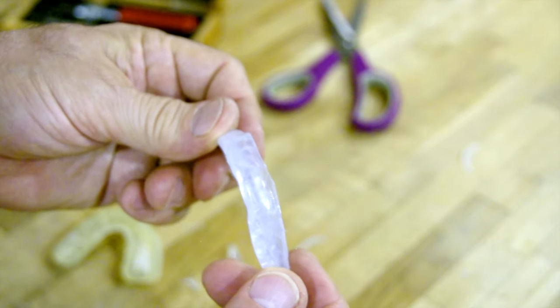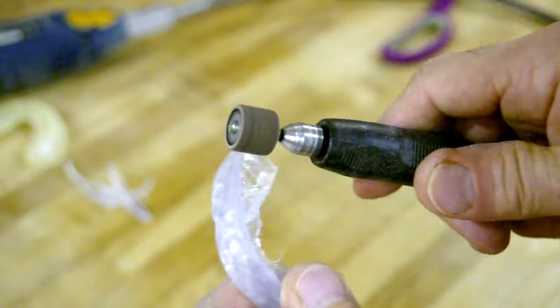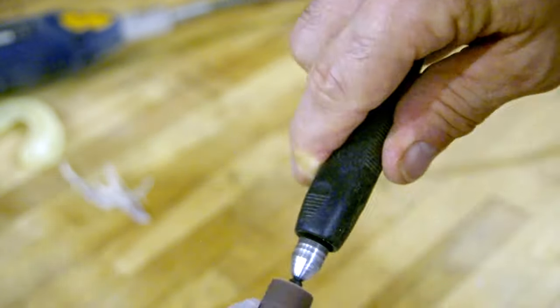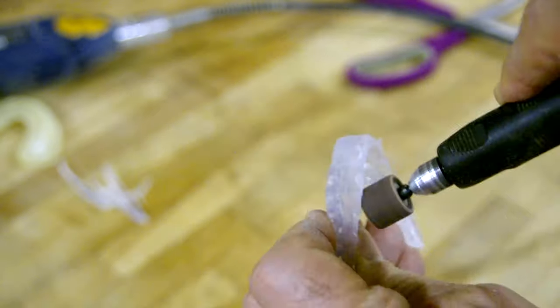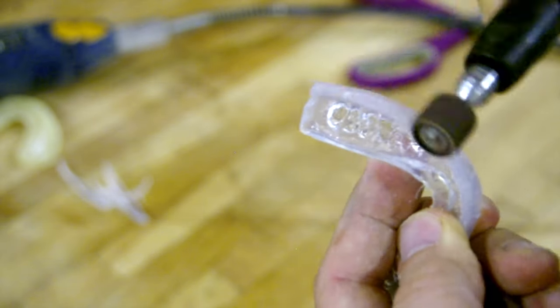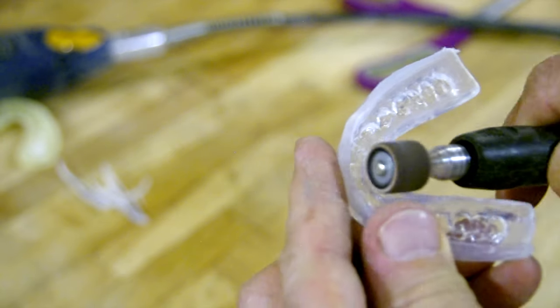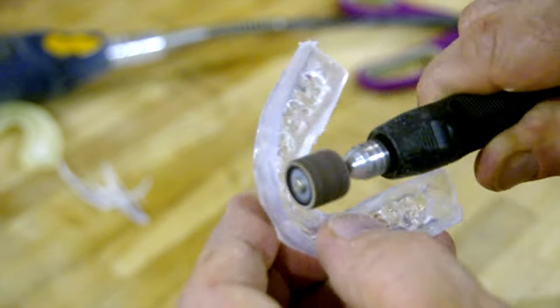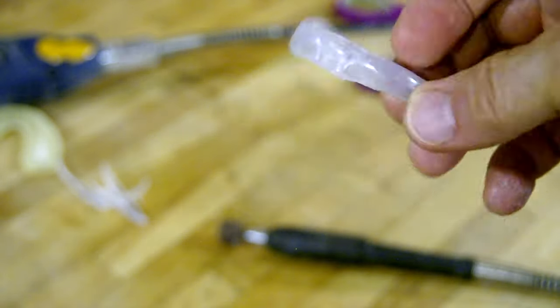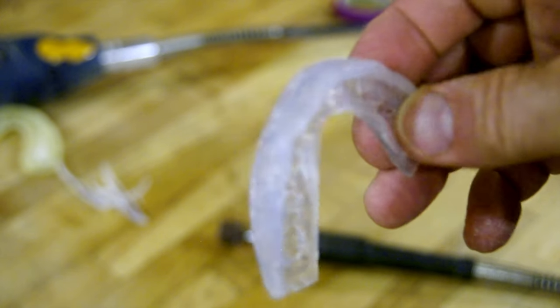So that's all trimmed and now we'll sand it down with the dremel. It took about two minutes of sanding with a 60-grit dremel sanding disc to get it smoothed out so that it wouldn't cut the inside of my mouth. You could use sandpaper, you could use a file — there are a number of ways to smooth it out, but you do want to do that so it doesn't hurt your mouth. Now we rinse it and see how it fits.